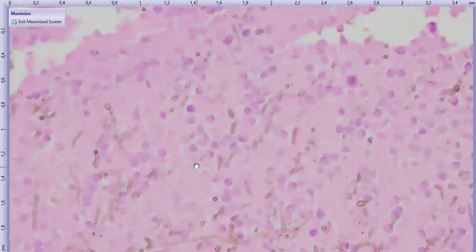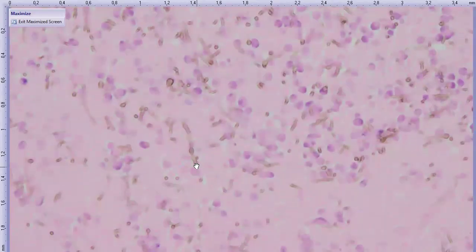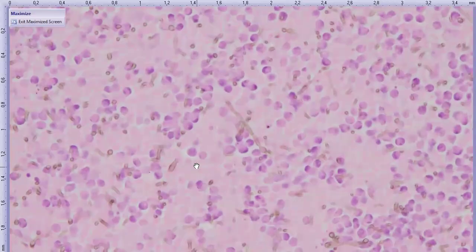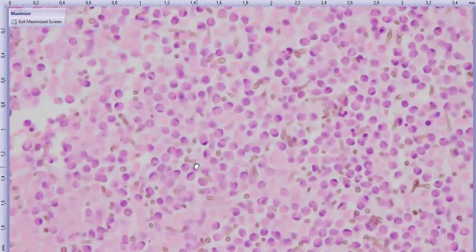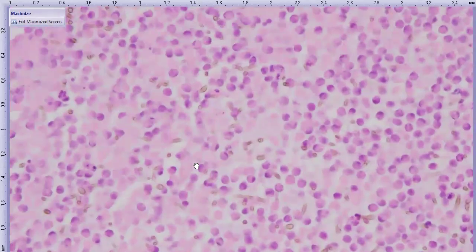The diagnosis of fungal hyphae histologically, or identifying the species and genus, is kind of hard. But this one has a big clue, which is the fact that it is melanized. So we know we're dealing with a group of fungi called dematiaceous fungi or pigmented fungi, which are saprophytic fungi that can cause infections as opportunistic organisms.